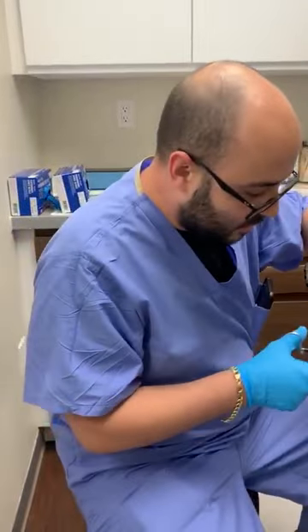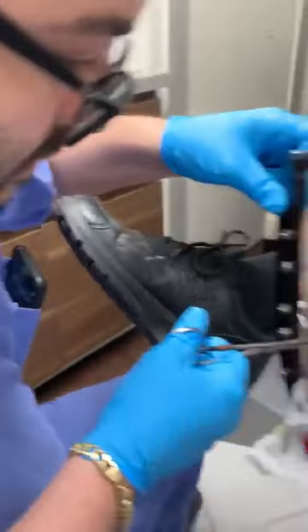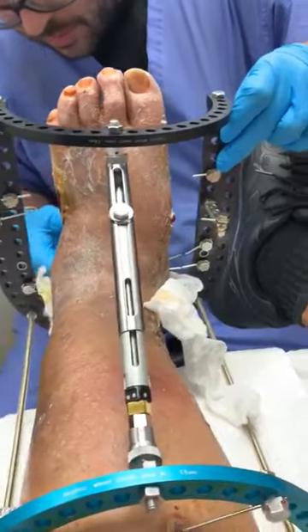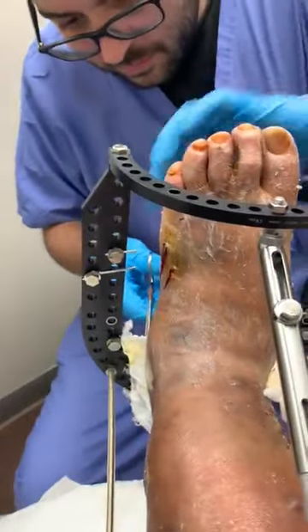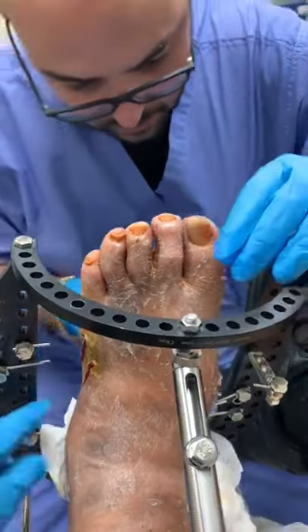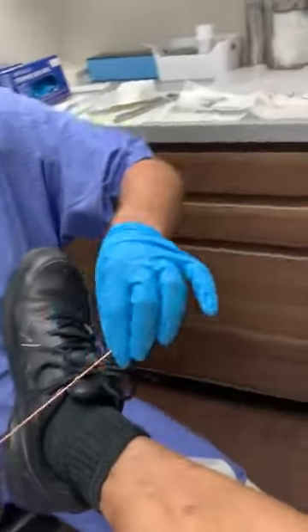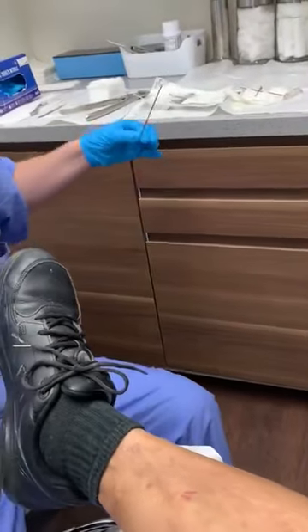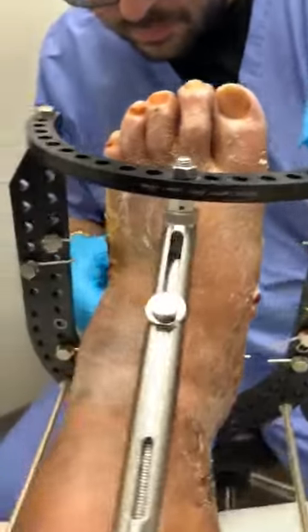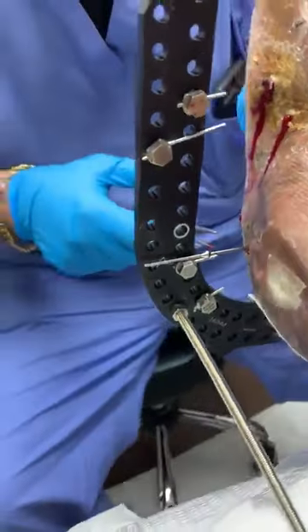So now we're just going to be removing the pins. I just kind of pass it through — it makes it a little easier. There it is. There's a pin. One down.